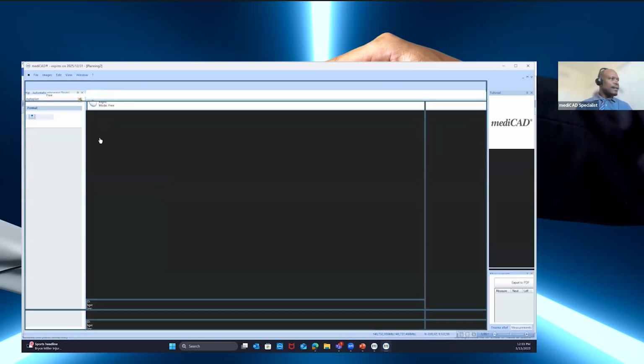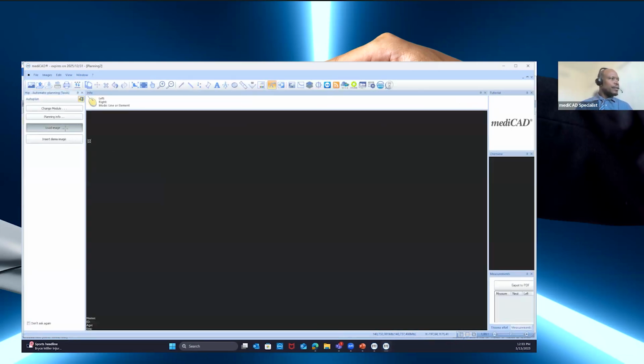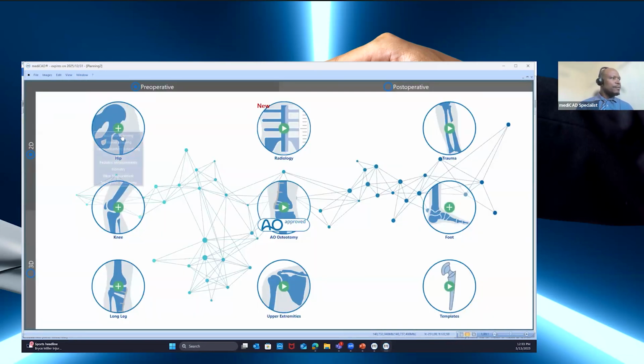So let me go back, load the demo. Well, not loading the demo.